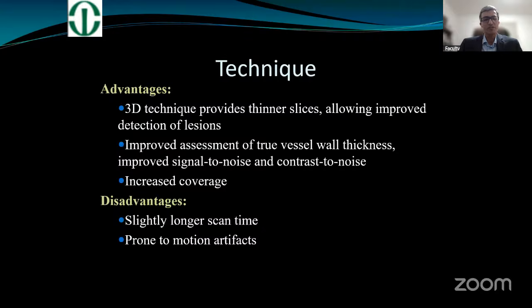Okay. And another advantage is, as we do it on a 2D sequence, the physician has to be there at the scanner guiding the technologist on how to acquire the images, like where is the stenosis, and how do they acquire true axial, true sagittal, true coronal through that stenosis. With the 3D technique, they don't have to be; the tech can run the sequence. It's an isotropic sequence, and later on, we can do any reformats we want. So that's the main advantage of the 3D technique.